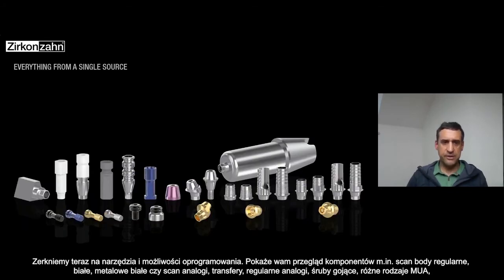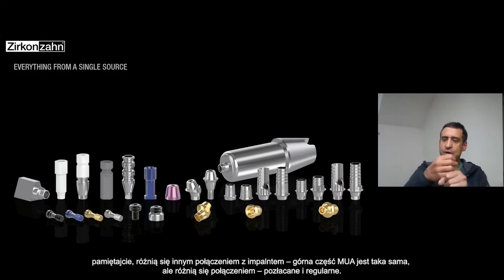Here you can see an overview about the components: the scan body regular, the white one, the white metal, the scan analog, impression copy, regular analogs, healing caps, different multi-unit abutments type one or type two. Remember: type one and type two is a different connection to the implant — the multi-unit on top is the same, but the connection at the lower part is different.